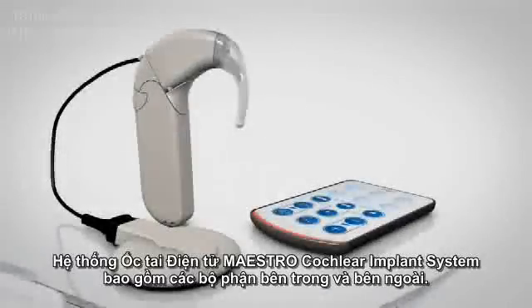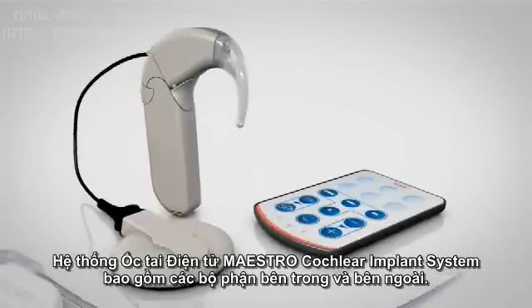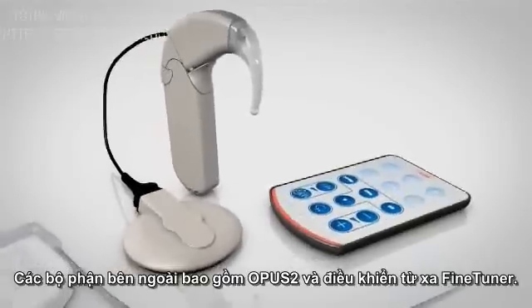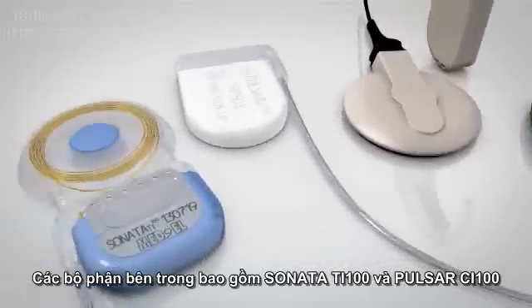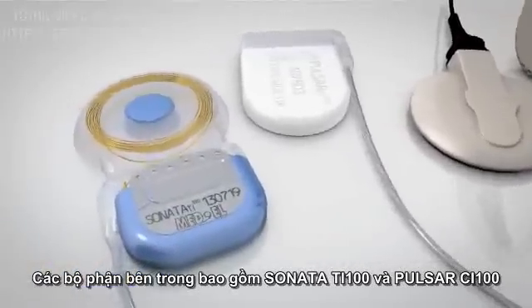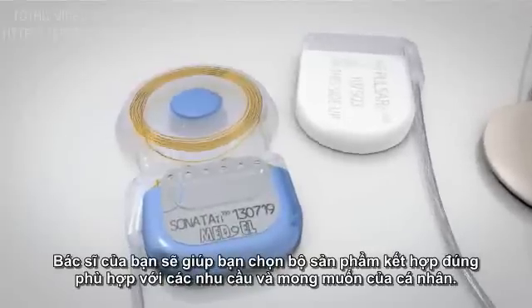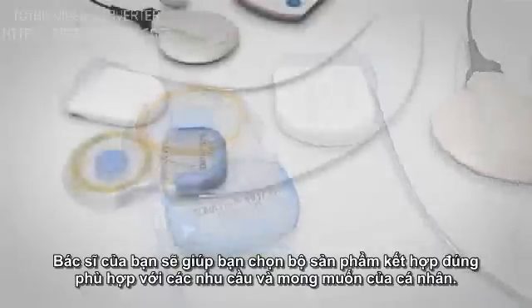The Maestro Cochlear Implant System consists of external and internal components. External components include the Opus 2 and the fine-tuner remote control unit. Internal components include the Sonata TI-100 and the Pulsar CI-100. Your doctor will help you to choose the right product combination to fit your individual needs and preferences.